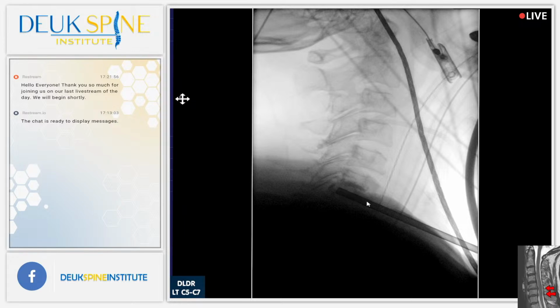Can you guys see that, Henry? Yes, we do. And that tube is at the back of the disc at 6-7.